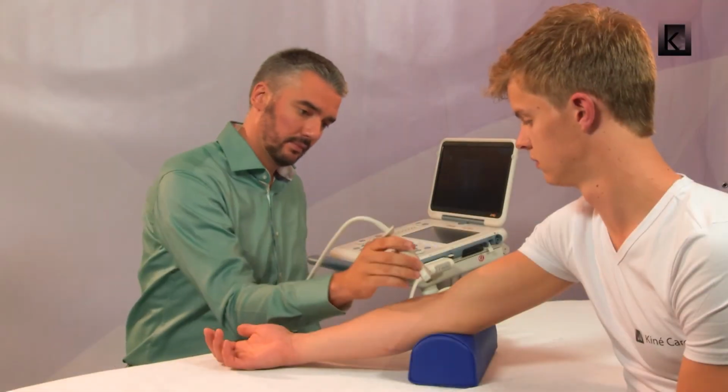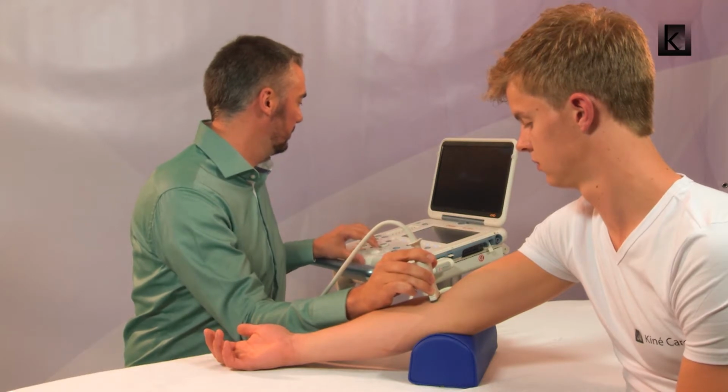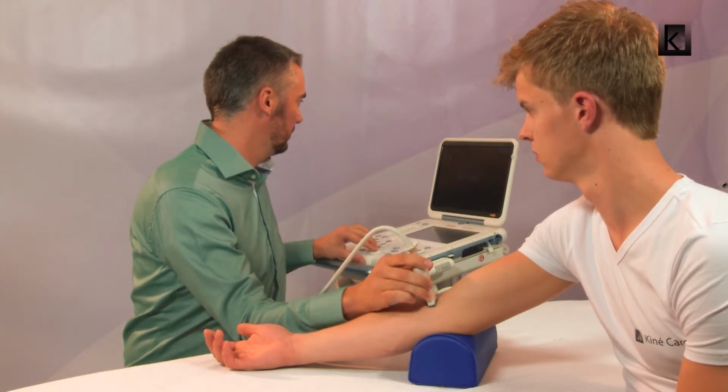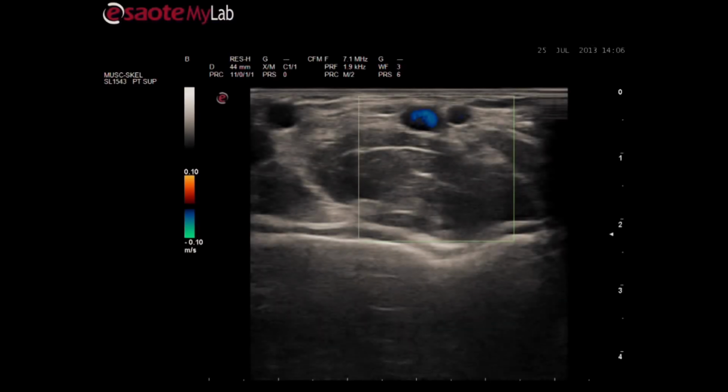The ventral elbow joint has lots of different anatomical tissues. Now I will show you an artery, muscle, capsule, synovia and bone. In the middle of the screen we can see two wave-like white lines with between them a black line. The lower white line is a trochlear bone. The black line is a combination of cartilage and synovia. The upper white line is the elbow capsule.